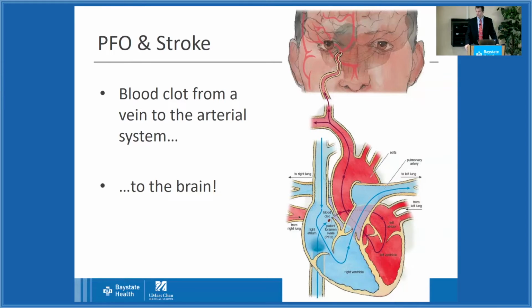So when somebody presents to the hospital with a stroke, and we find that they have a PFO, a patent foramen ovale, we offer to close it. Okay? Now, closing a hole in the heart can sound like something very scary, but the good news is that's actually about half an hour procedure, and they go home the same day. So let's talk about that for a second.